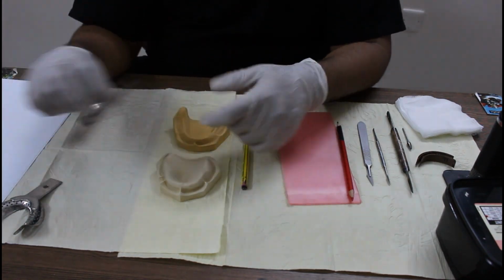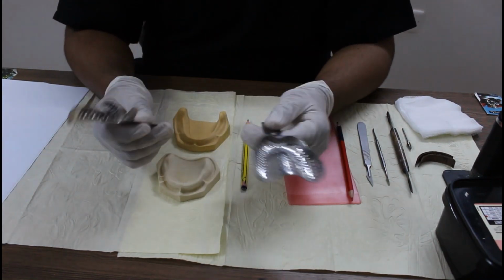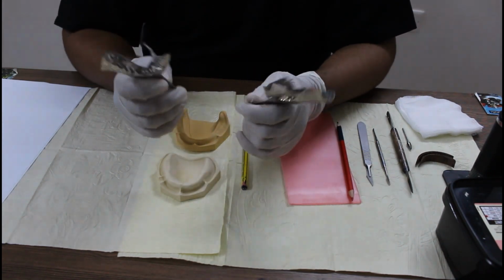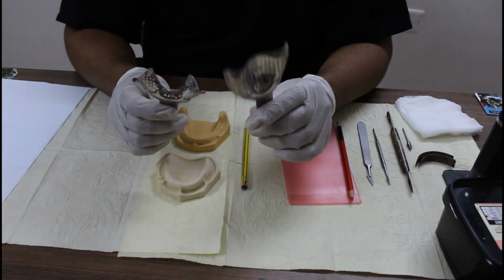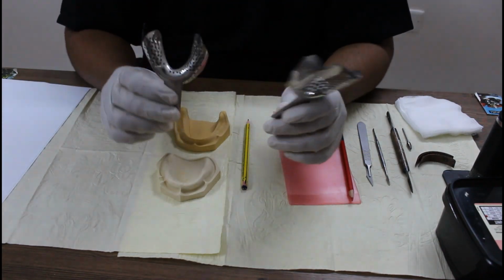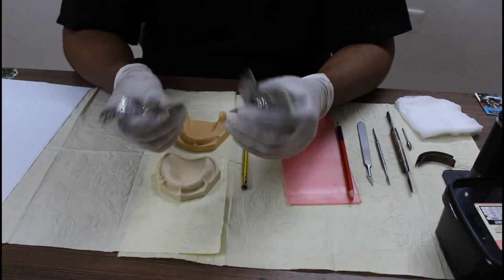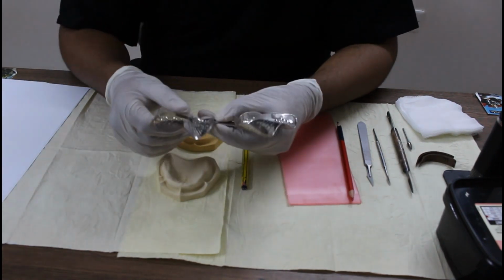In week 2 you all saw these trays. They are metallic trays called stock trays. These trays are available in the market and they have a fixed size and shape. They are not made according to any one patient. They have a fixed size and shape with size numbers U4, U3, U2, U1, etc. Same with the lower. Now, what is the procedure?